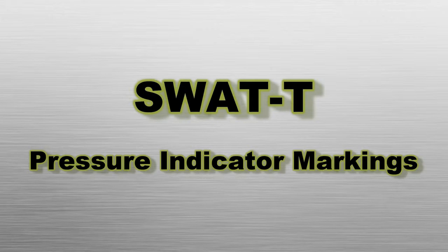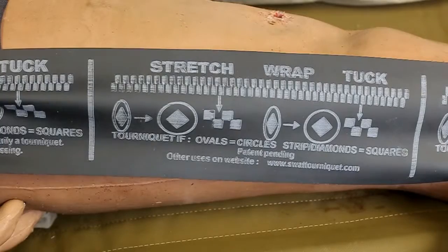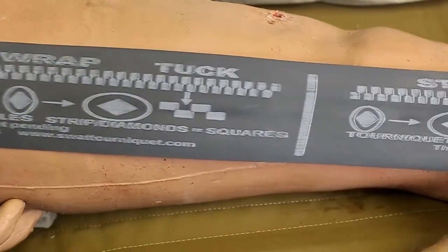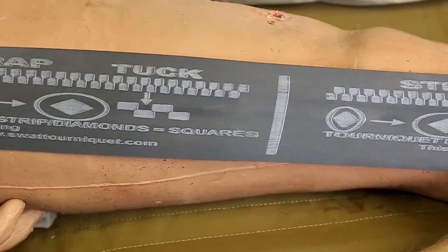Pressure indicator markings. The SWAT-T can serve as both a tourniquet, a device that stops blood flow to a limb, and a pressure dressing, a device designed to cover a wound and apply pressure. There are markings located along the exterior of the SWAT-T that visually indicate the amount of pressure being applied and thus in which mode the device is functioning.